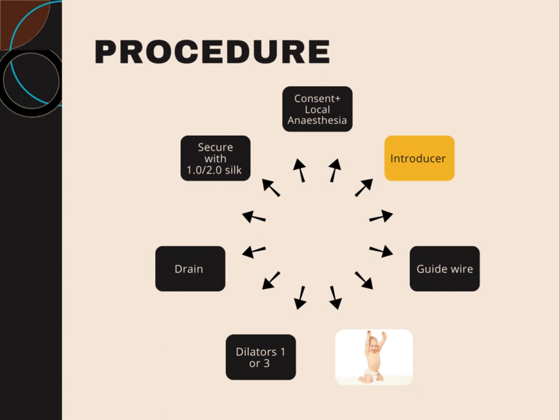And once you're draining, you need to be sure, according to the chest size, that it should be about 12 centimeter inside from the chest wall, and it should be draining very well. Then you can attach the underwater seal tubing set. And the last step would be to secure the drain, whether it is for pneumothorax or for pleural effusion.